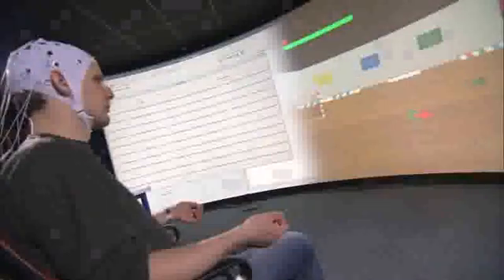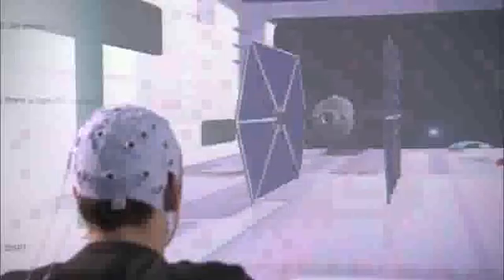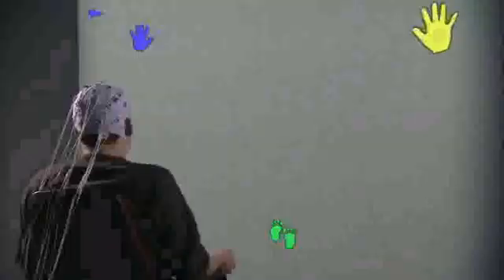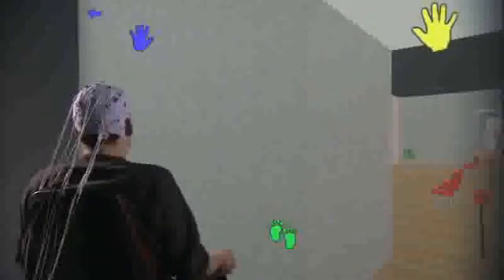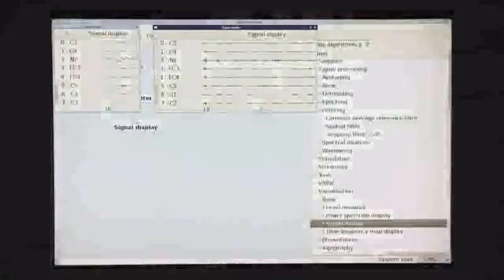OpenVibe is a software platform for designing, testing and using brain-computer interfaces. It is software for real-time processing of brain signals and can be used to acquire, filter, process, classify and visualize brain signals in real time.